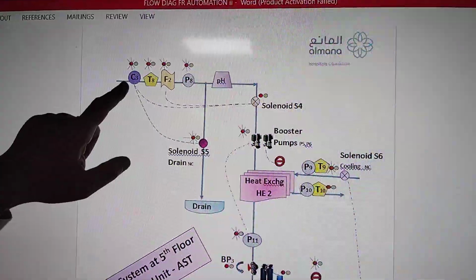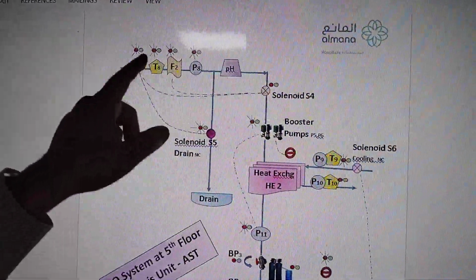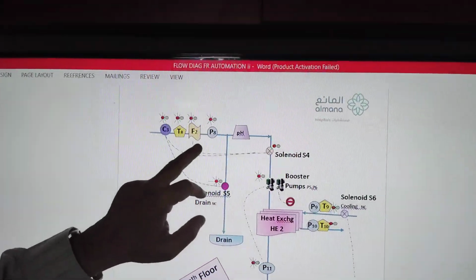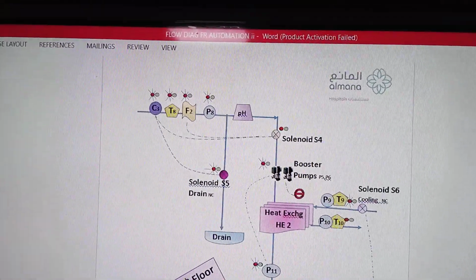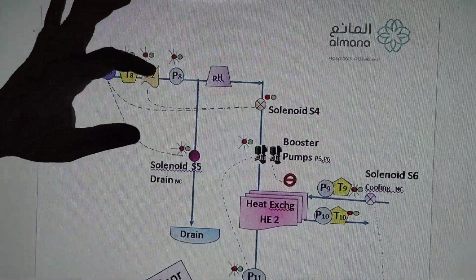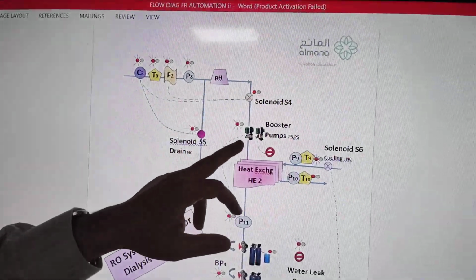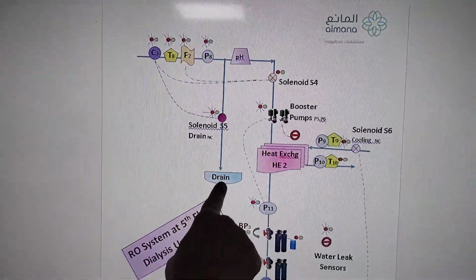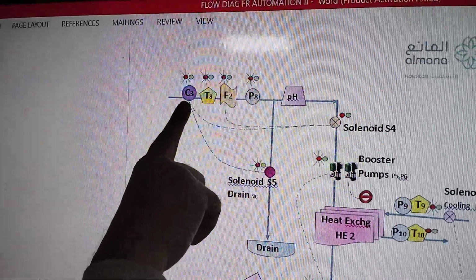Conductivity is being monitored over here. If the conductivity is high, then it will go into the drain. If the conductivity is normal, it will go into the normal flow. And then temperature and flow also, as discussed in the past. If the flow goes more than the limit, then we consider that the water is draining out somewhere, or it's overflowing and going to the waste actually. So this has to be controlled. It will give an alarm, and then the pressure and pH are being monitored. If the conductivity is high, then it will go to the drain. This solenoid will be on only in case of high conductivity, no other case.